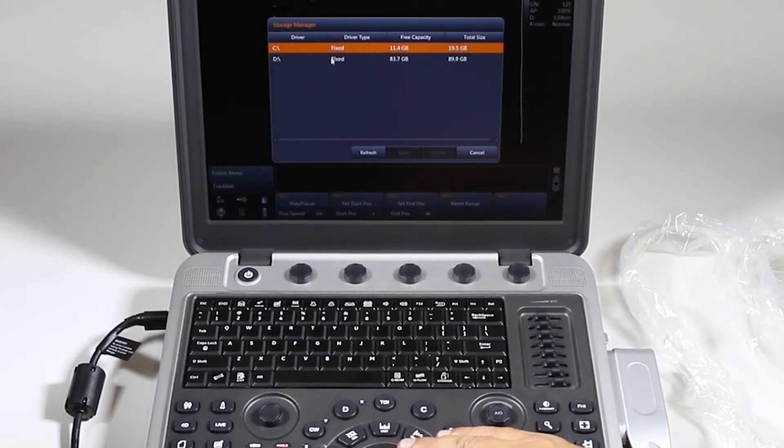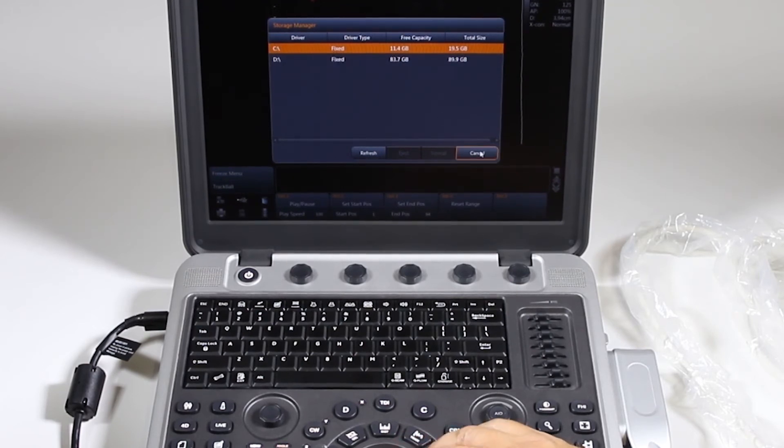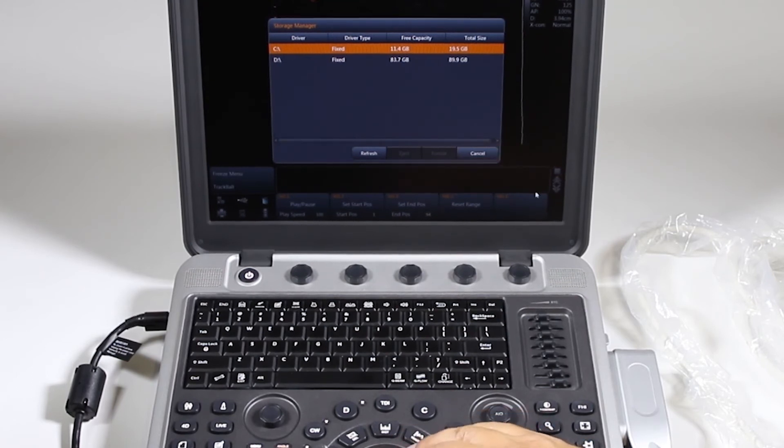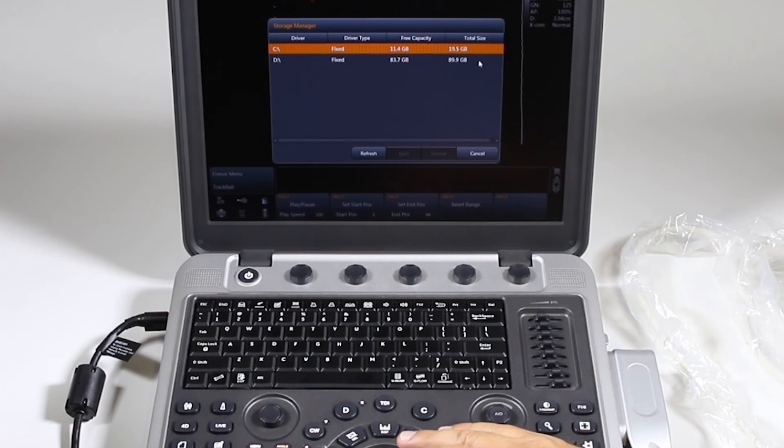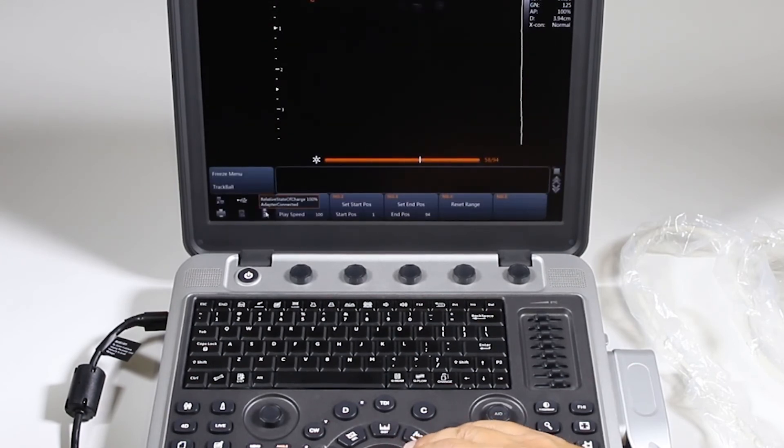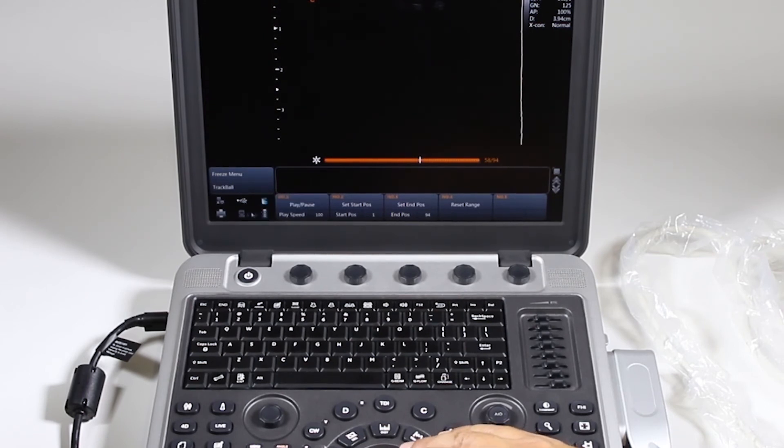It has two sections of hard drive here. One for patient, one for system settings and operation system. If you have a USB, it will tell you about that here, about how much is free and the total size of that USB drive. This is your battery indicator. It says that the adapter is connected, but when it's not, it will tell you how much battery life is left.